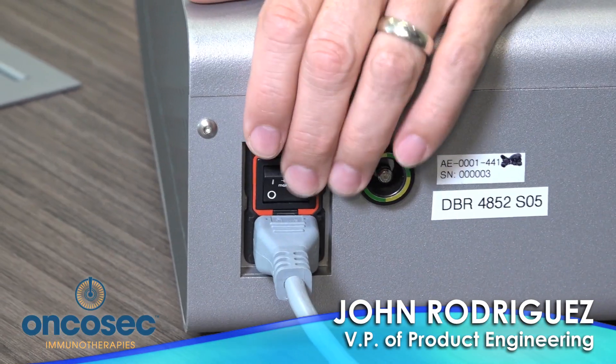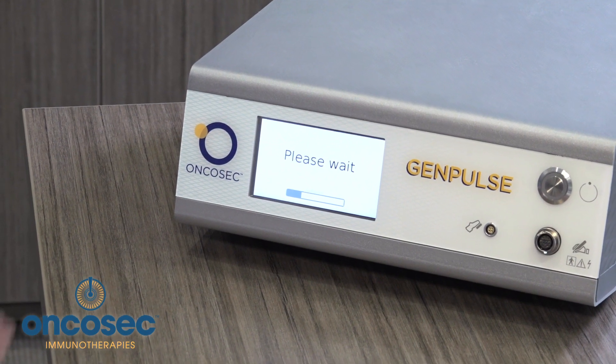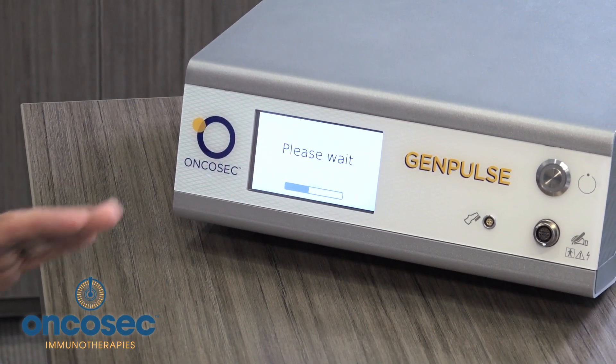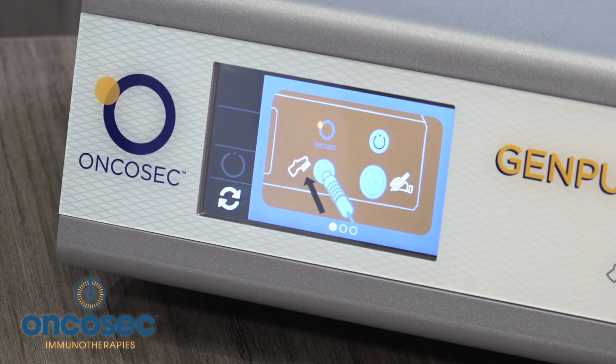After the power cord has been connected, reach the rear of the device and power on the system. After power is on, the unit will go through a self-check to verify that everything is functioning properly. The user display explains exactly what the next steps are.